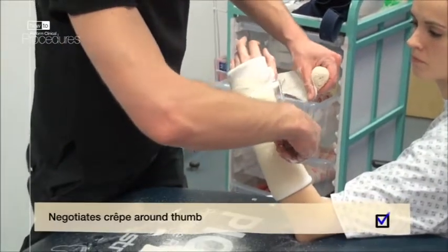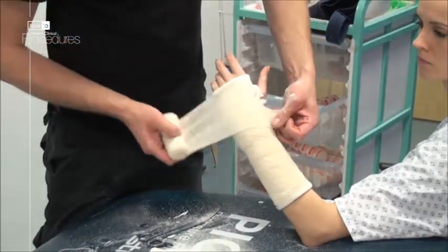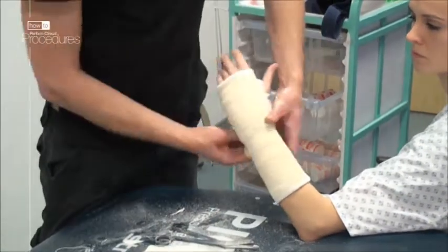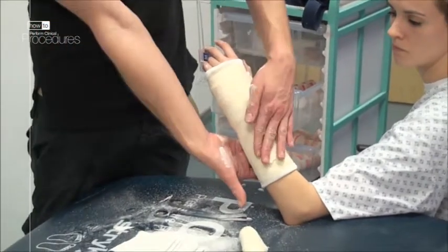At the base of the thumb, trim the bandage to accommodate the digit, passing the bandage through the grip. Do this twice and work your way back to the elbow. Finish the crepe bandage on the actual back slab surface itself rather than the underside.